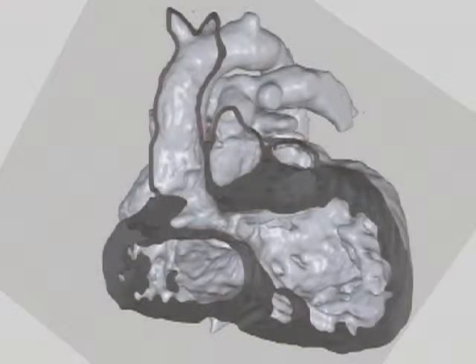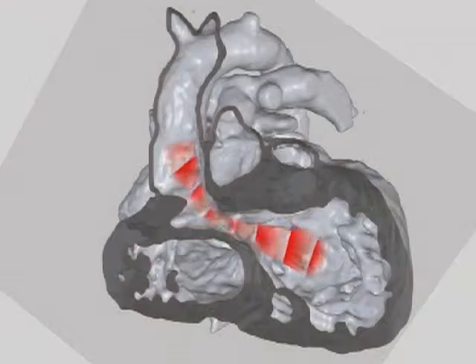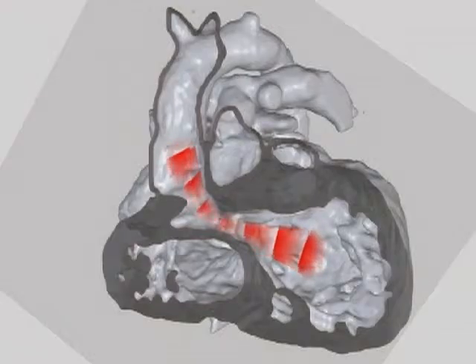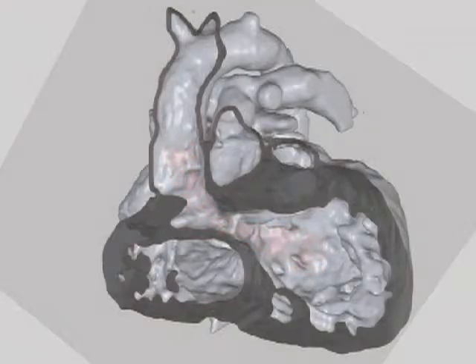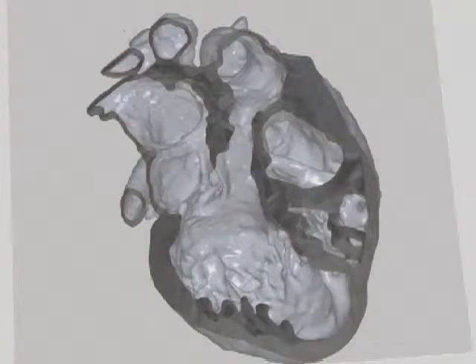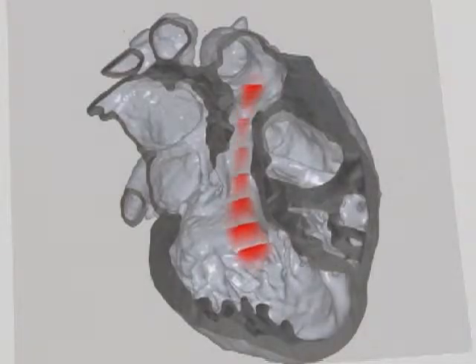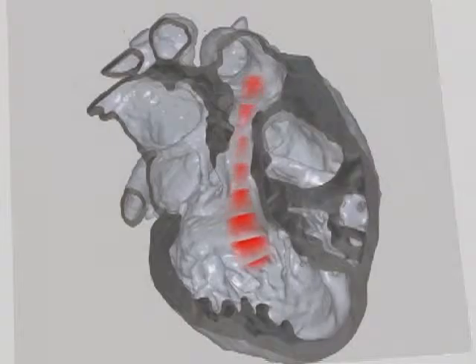By means of surgery, a patch forming a tunnel was inserted to lead the blood from the left ventricle to the aorta. This image shows a different cut through the heart. Again, we see the tunnel leading the blood from the left ventricle to the aorta.